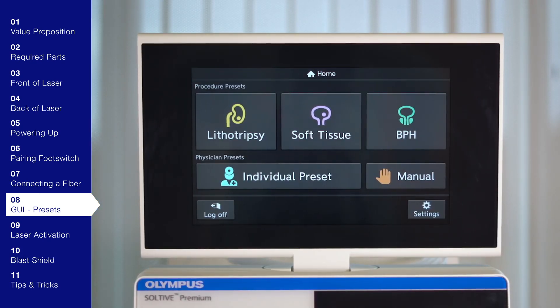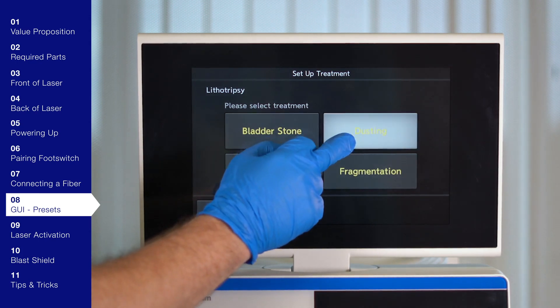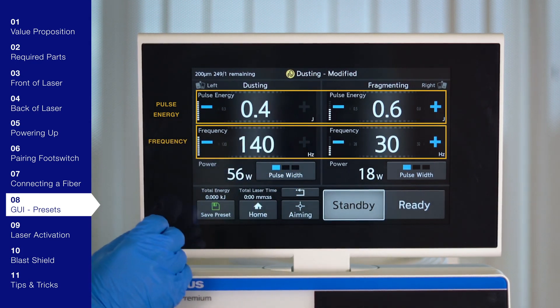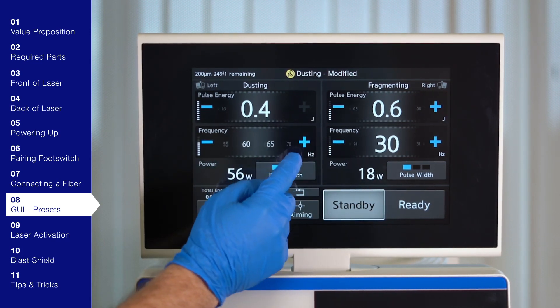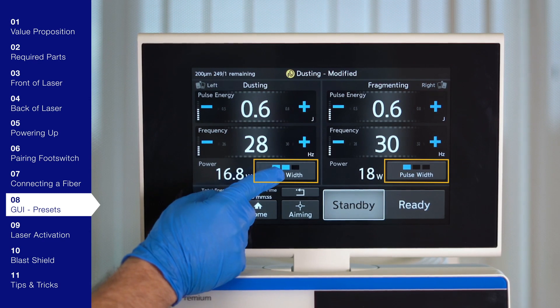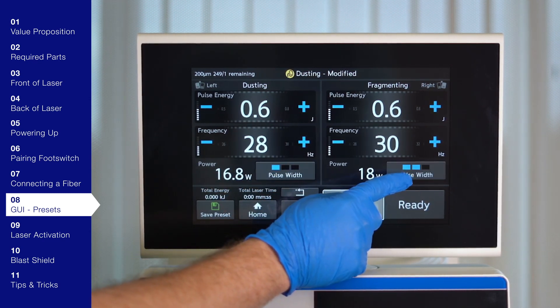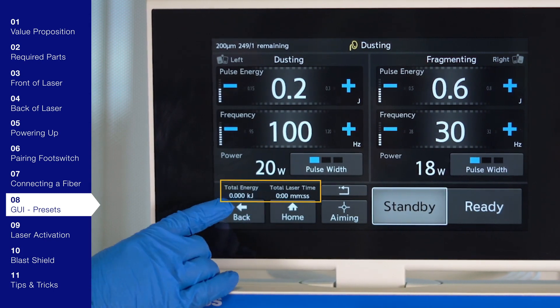We recommend our presets, but if the physician would like to adjust settings, select the appropriate treatment preset or manual mode from the home screen. Press the touch screen to adjust the parameters on a selected mode. Adjust the pulse energy or frequency by sliding your finger over the parameter, tapping the plus or minus buttons, or holding down the plus or minus buttons. There are three options for pulse width: long, medium, or short — select by pressing the pulse width indicator button to toggle between settings. At the end of the procedure, you will find the total energy and total laser time used in the lower left side of the user interface.